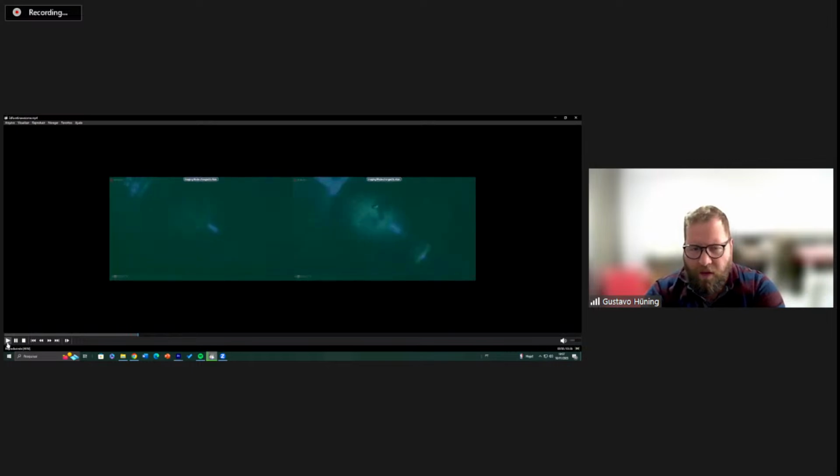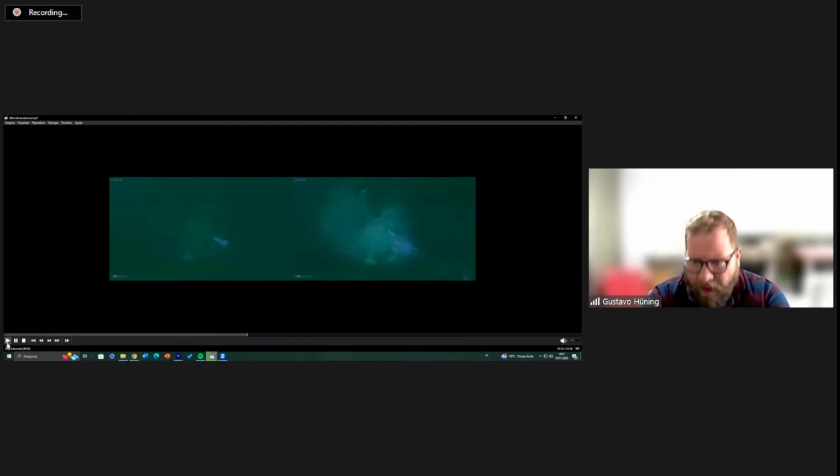As was mentioned before, I think by Lucan, you need someone with the keyboard controlling it and someone who understands it. Otherwise you will lose a lot. You can see on the left side there is more contrast, but you lose a lot of images. Some things you cannot see properly. And here you can see the leakage. As I was talking to Ahmed, I think it helped us understand the physiopathology of the proliferative disease much better, and why these patients have different cataracts when they are diabetic, because all those inflammatory cytokines attack the posterior part of the lens.